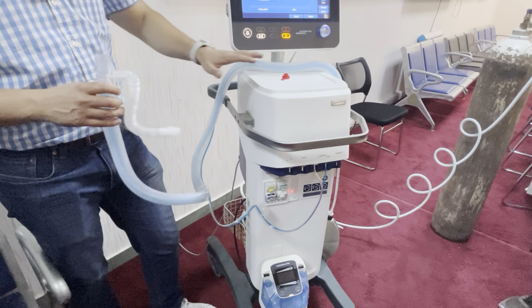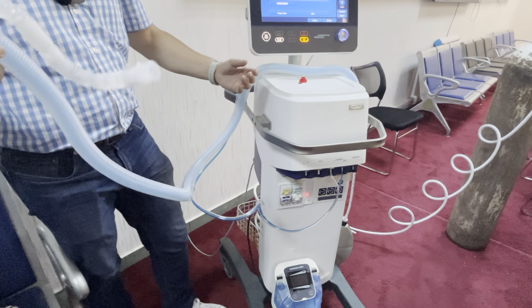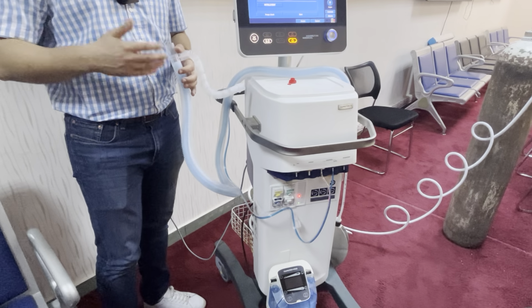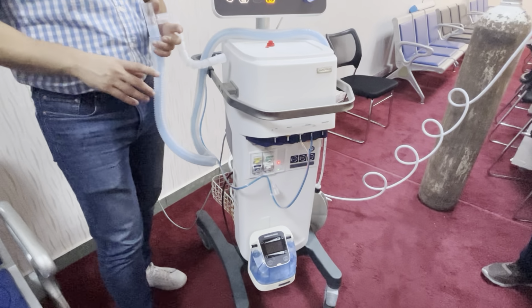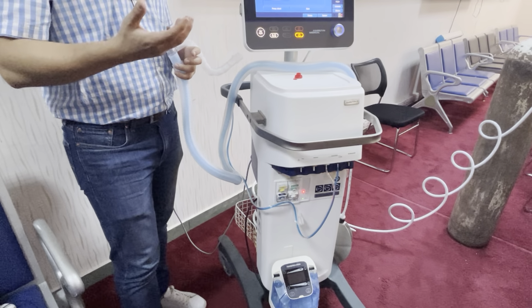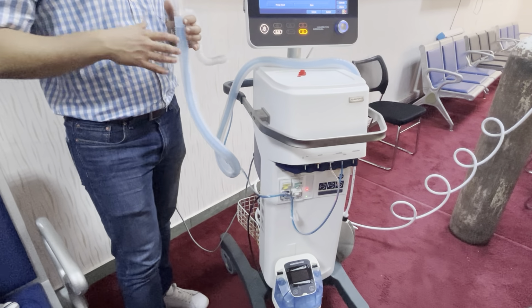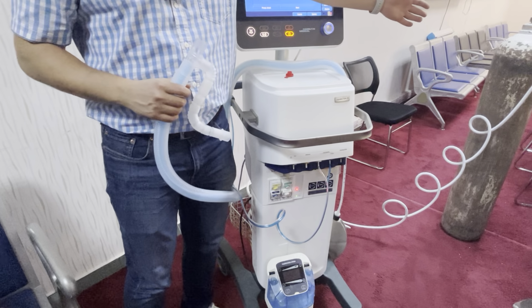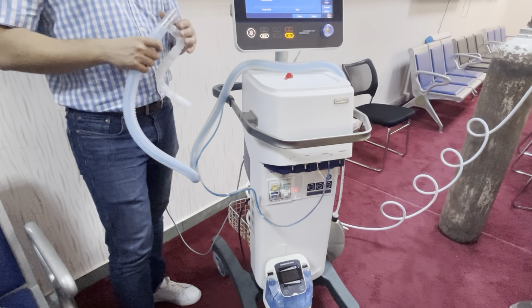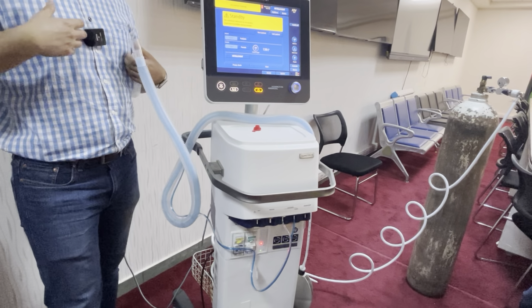If the patient will stay connected to the ventilator for less than 4 hours, we can use a normal breathing circuit or anesthesia circuit without heating. But if the patient will stay connected to the ventilator for more than 4 hours, in that case it's mandatory to use the humidifier. The humidifier is like an artificial nose. It adds some temperature plus some humidity to the air in order to protect the airways of the patient, because the machine uses dry and cold air and oxygen. If the patient is ventilated with dry and cold air for a long time, the airways will be dry, the secretions will be very thick, and the mucosa will be damaged.